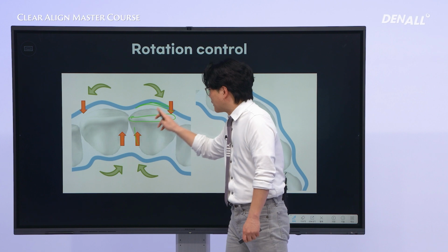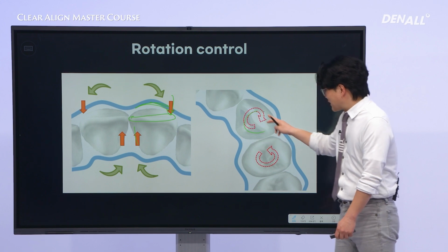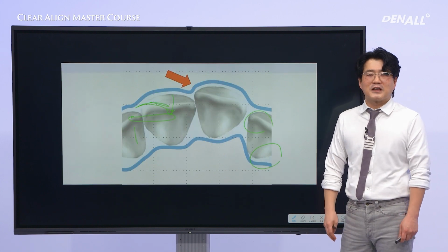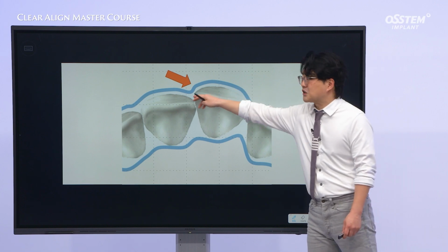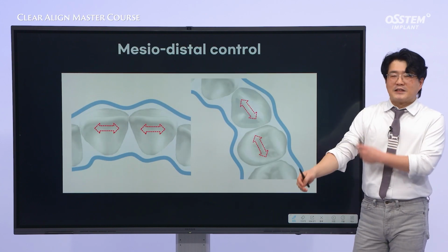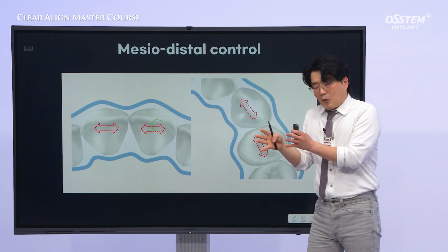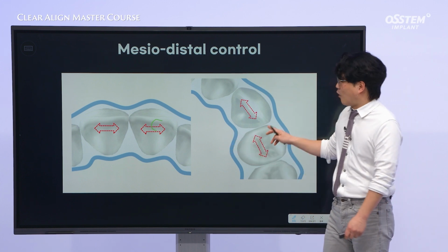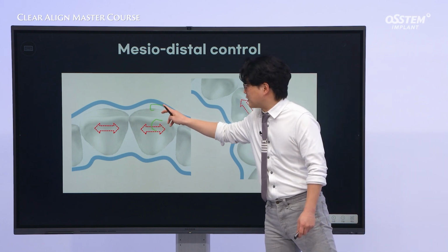Now, if you push it, it's going to be moved, but when you have rounded teeth, small teeth, or microdontia, it's going to slip, which makes tooth movement harder. However, when there's a little bit of crowding, there are edges to push against. In this case, tooth movement can occur. Let's take a look at the MD movement. Even if it is wide, can the aligner grip it from front to back and push it side to side effectively? Not really. This kind of tooth movement is more difficult. That's why we apply attachments to use that side for a case like this.